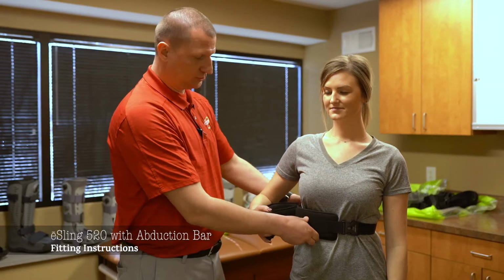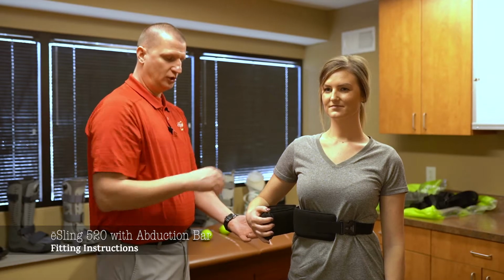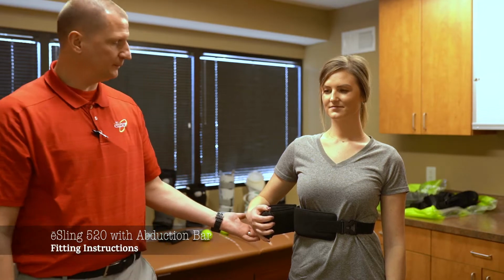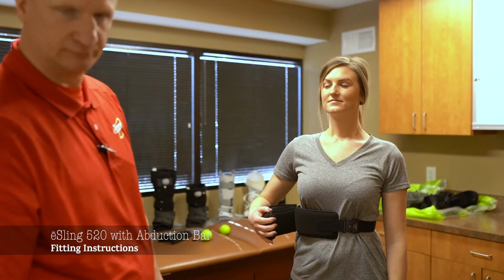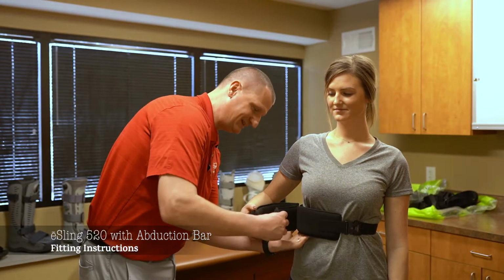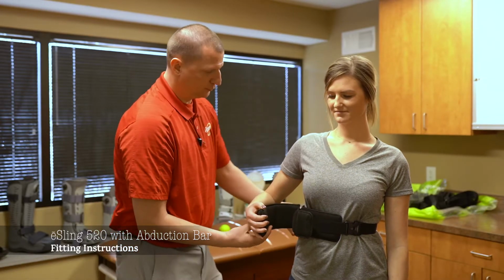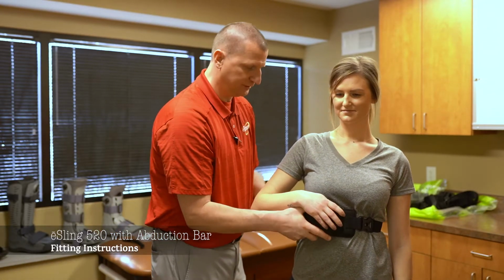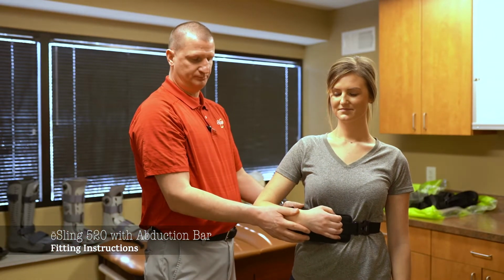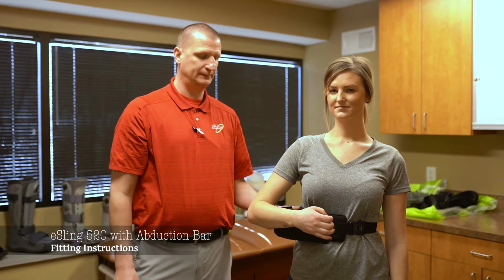When this is nice and secure to her side, then we're able to switch the arm rail and the support strut to different positions. Right now she's set up in more of what's known as a neutral position, but by unvelcroing these, we can set her up to other positions as well. Bring her over like this, we'll bring her more into what we call the 15-degree abduction position, which is very common with physicians, like I said, with rotator cuff surgery.